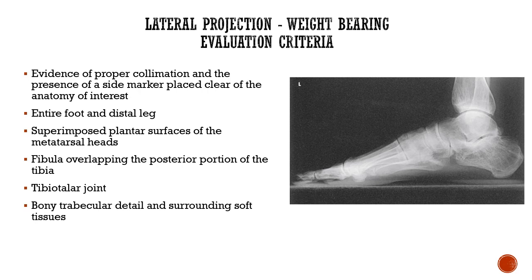So we're looking at the foot and the entire distal leg. We're looking at the fibula overlapping the posterior part of the tibia, and we can see the tibio-talar joint space.